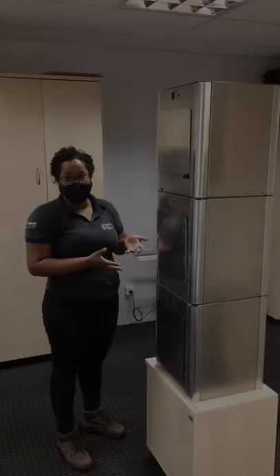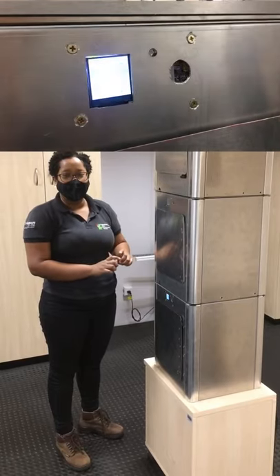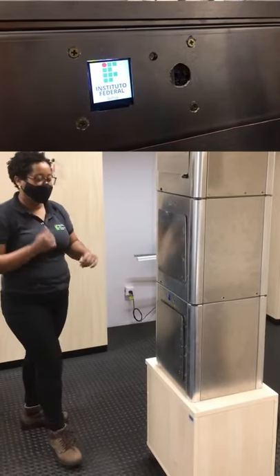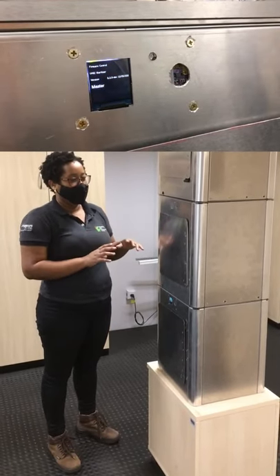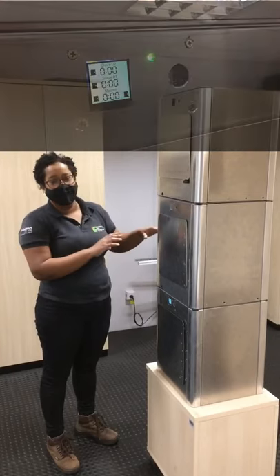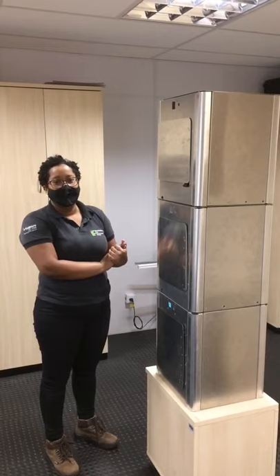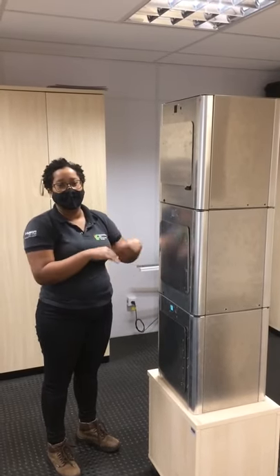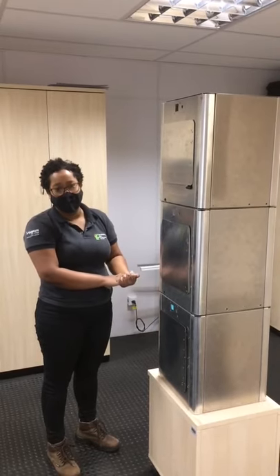Agora a torre está ligada já. Nós fizemos alguns takes da telinha de inicialização do equipamento, que a gente vai colocar também no vídeo. Os módulos fazem a esterilização de forma independente. Então, a gente pode acionar eles ao mesmo tempo e também em momentos diferentes. Lembrando que a alimentação está sendo feita pelo mestre.